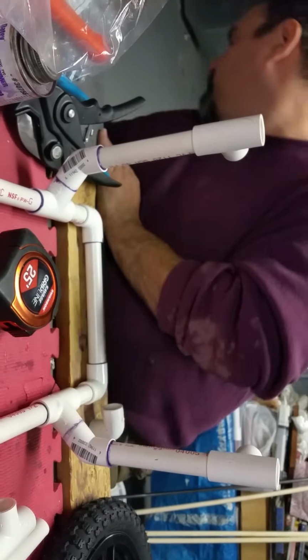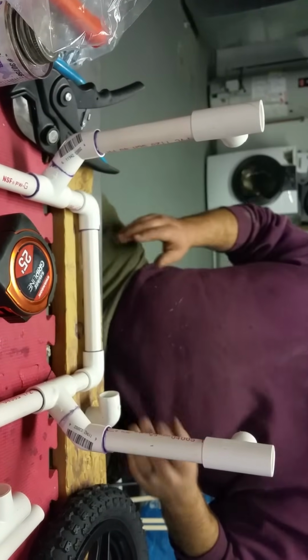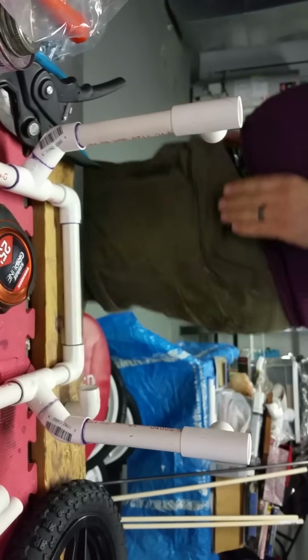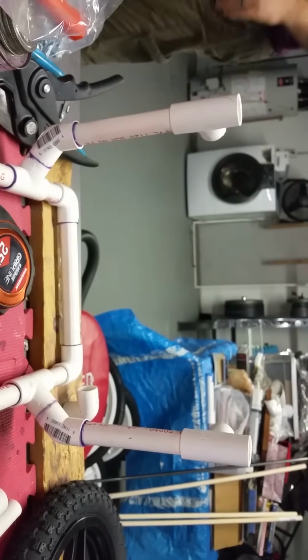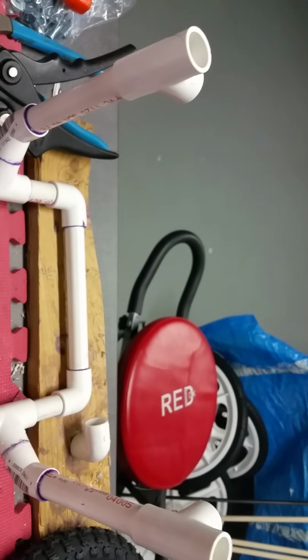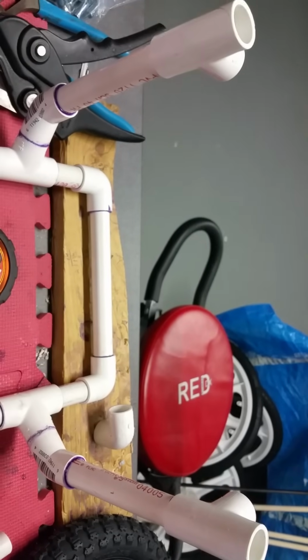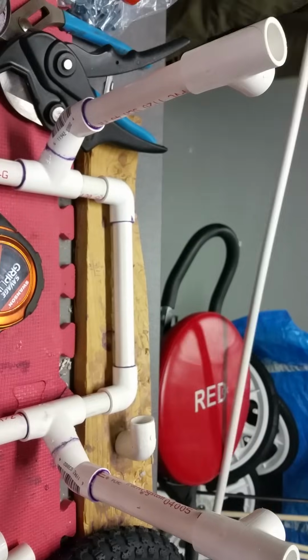And it's going to be larger than your top support bar because we've come out the width of the wheels. So we have to remeasure, and that was the 11 1/4. So this cart's going to be a little bit wider on the bottom than it is on the top, which is fine. It's not going to be squeezing the dog.